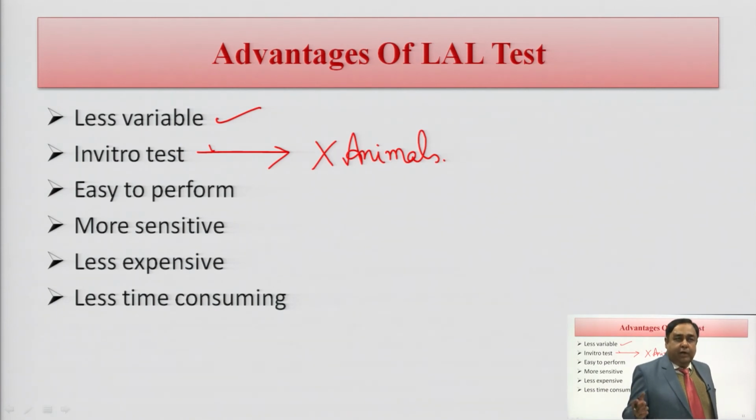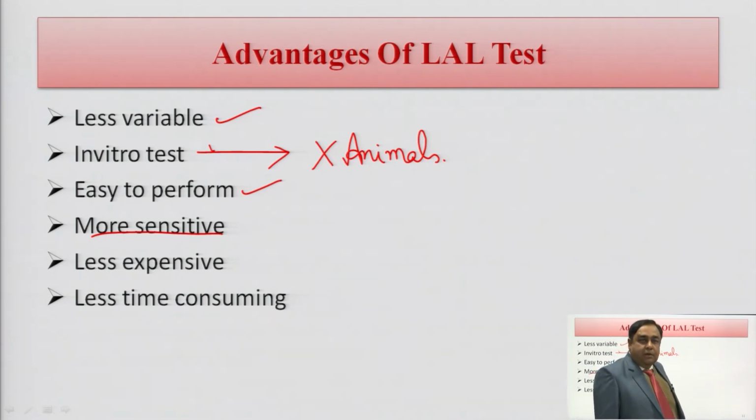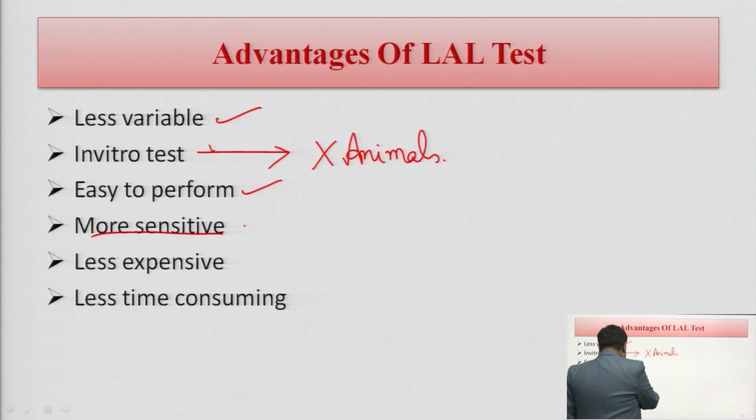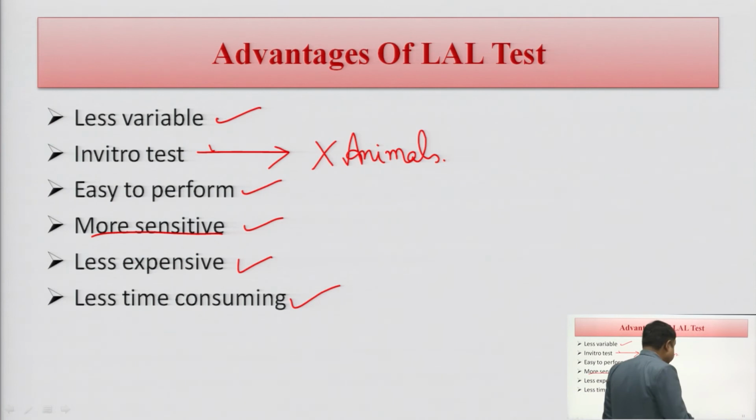We need not take the approval of CPCSEA also. It is very easy to perform. Above all, the LAL test is much more sensitive, less expensive and less time consuming. Due to these advantages, the LAL test is more recommended in various pharmaceutical industries.